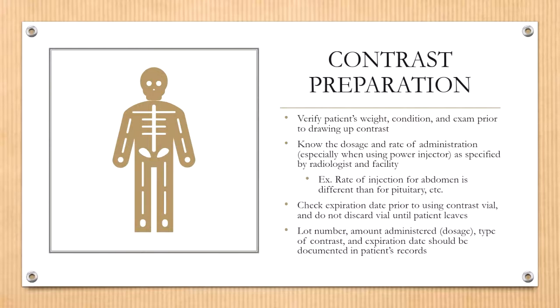So as we prepare the patient for the exam, we need to make sure that we verify their weight so that we know their dosage, as well as for SAR limits, because we do need to input that information into the console for RF safety. Also, we need to make sure we take their history, talk about their condition, what they're experiencing, explain the exam to them, and discuss the fact that we're giving them contrast.